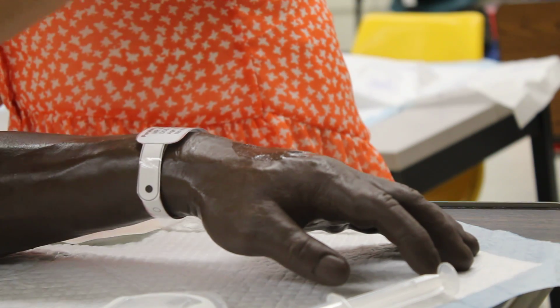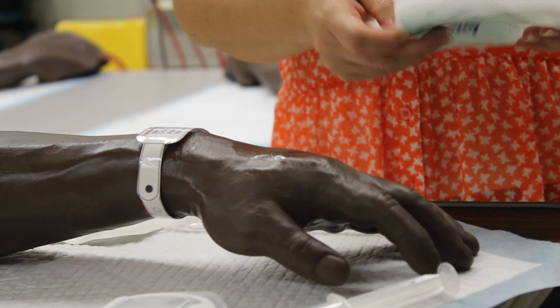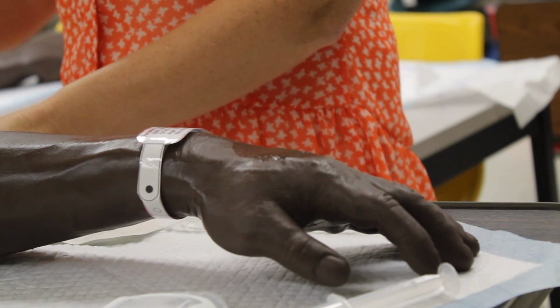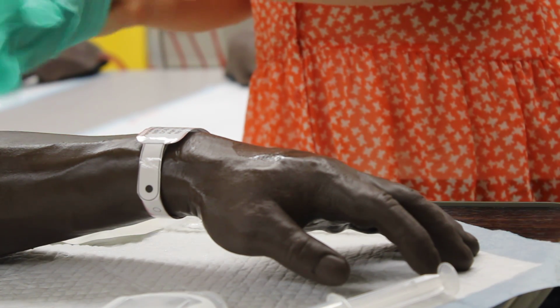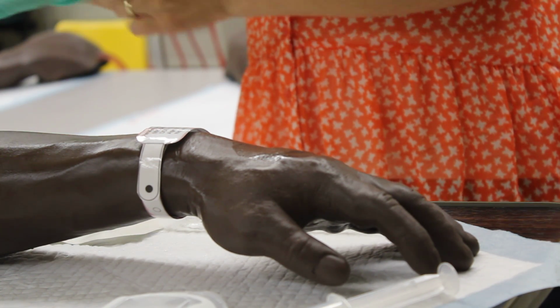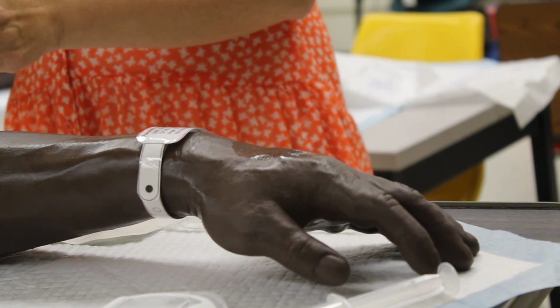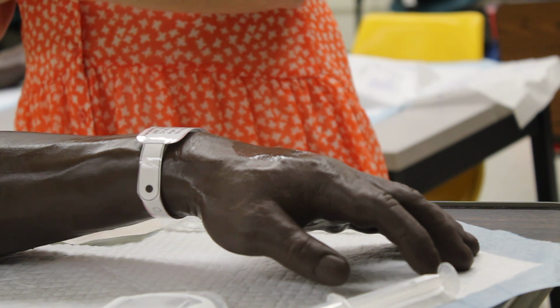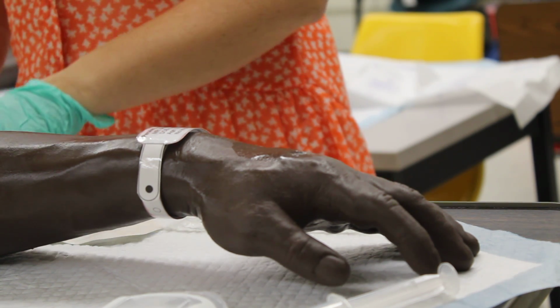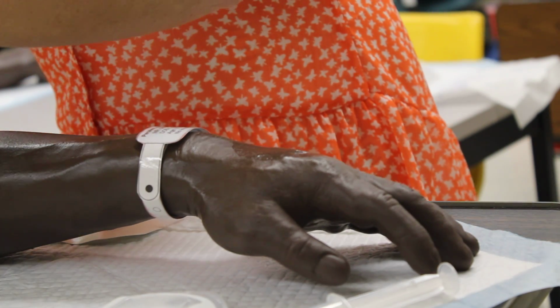I can go ahead and put my gloves on. My gloves come in as a sterile set, but they do not have to be put on like sterile gloves. And if these gloves in the package do not fit you, feel free to get a pair of non-sterile gloves that do fit you. So after I have that on, then I can reapply my tourniquet. Get my vein ready.